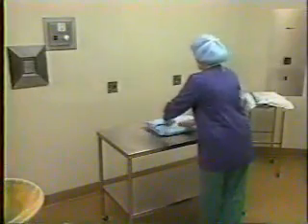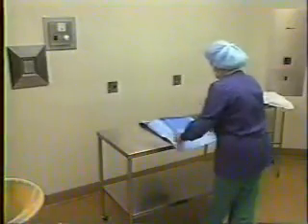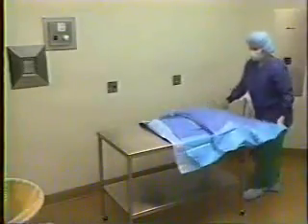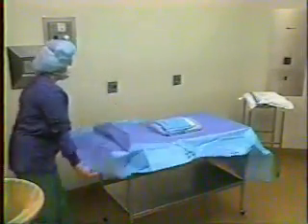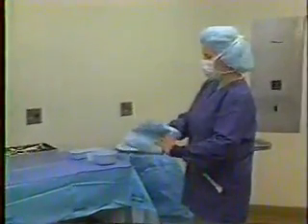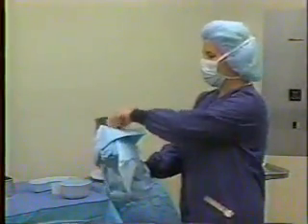With some commercial packs, place your hand under the fold of the material. Open the back and then the front flap. Each side flap should then be opened. Care should be taken to walk around the pack and not reach over the sterile field. When opening small packages, open the far side first and the near side last. Secure the wrapper tails so they will not spring back and contaminate the sterile item.